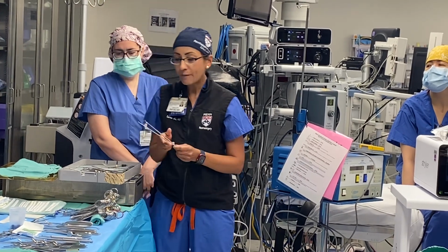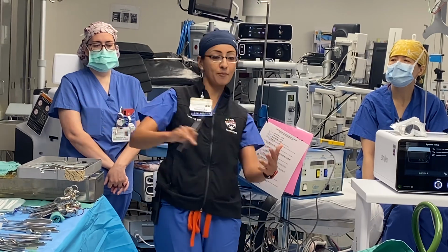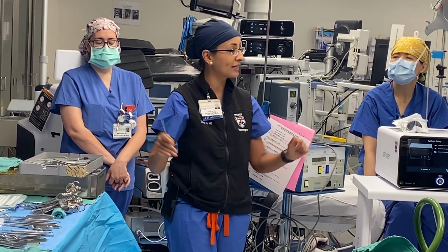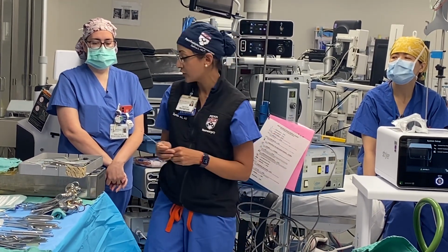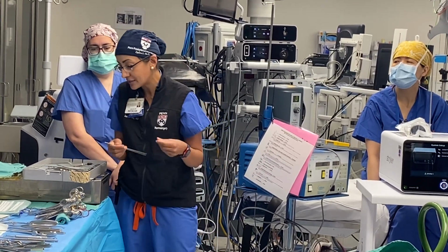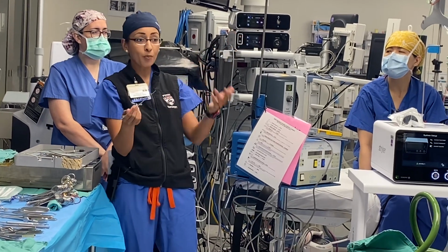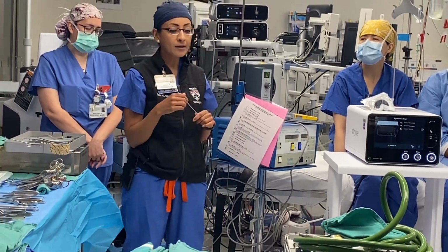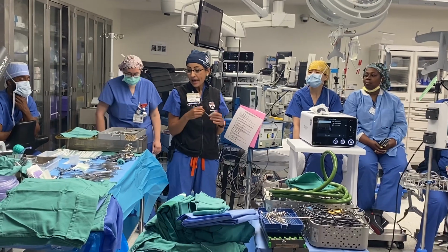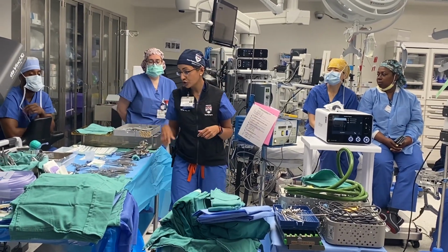Usually, before we're going into the head, we set up the Mayo with the Roten instruments so we can just plug and play in terms of which one we're going to use. Now's where all that micro dissection happens. A lot of the times we will use the microscope at this point too. And then we are basically dissecting and taking out, for example, tumor.